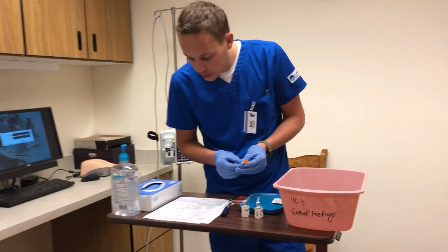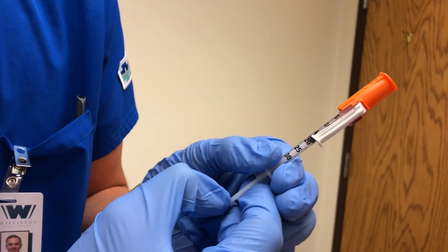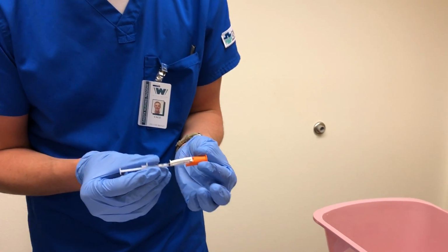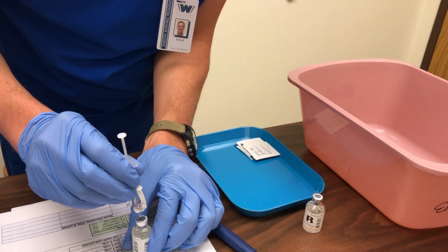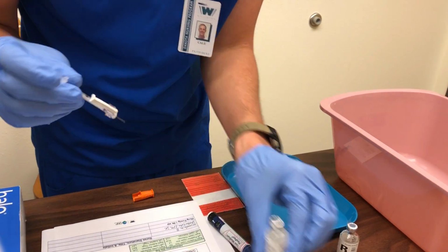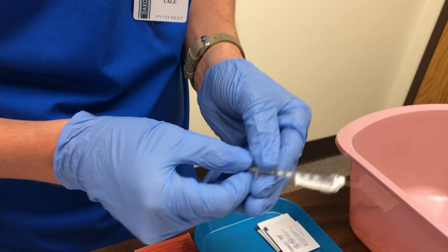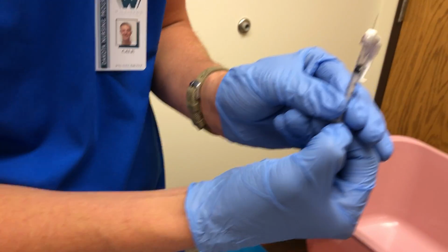Pull back. So for the NPH it says 15 units. So I'm going to pull this back to 15. So that's at 15. I'll pull that off and set it there. Okay, and then I'm just going to pressurize it. Pull it out, and then I'm going to pressurize this to 10 units for the regular insulin. So we're at 10.